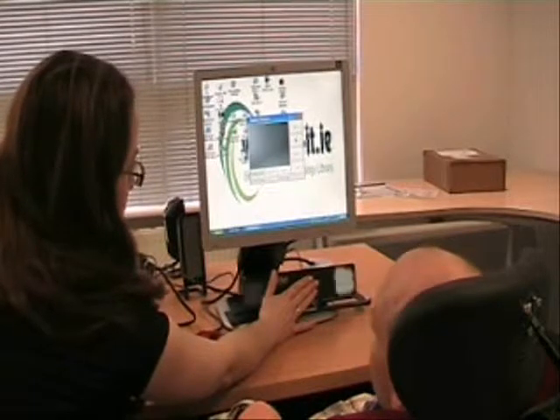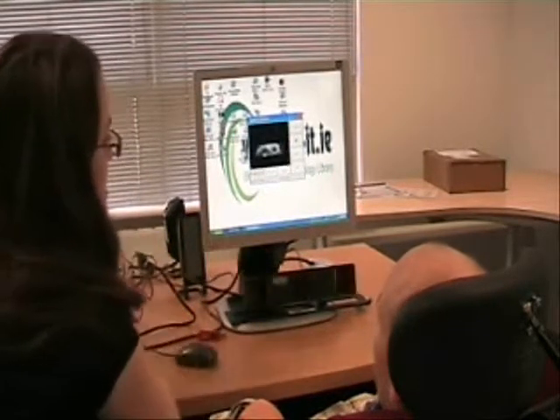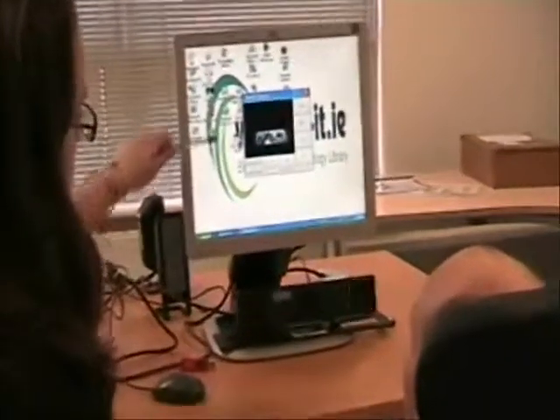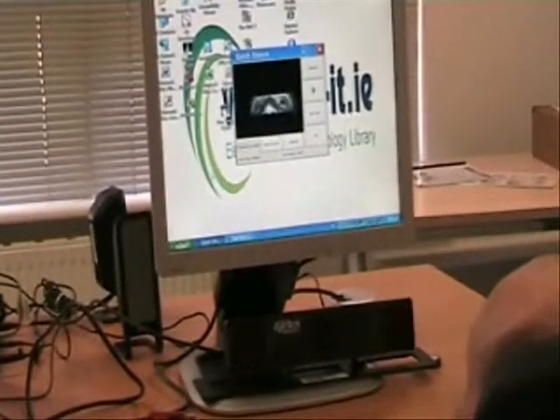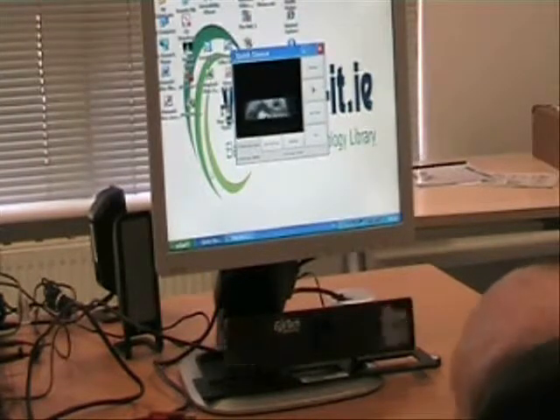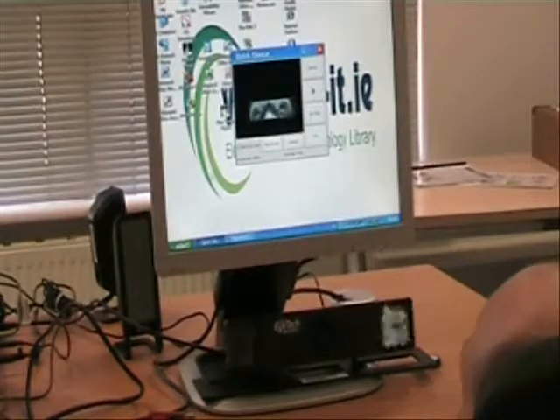Okay James, so we want to calibrate the TM3. The first thing we're going to do is let the camera find your eyes. You can see it's found both your eyes there fairly quickly. One of the nice things about this program is it will actually follow your eyes as you move up and down in your chair, so it should be able to follow them. You can see you've got different coloured X's over both eyes — your right eye is a red dot and your left eye is a blue dot.